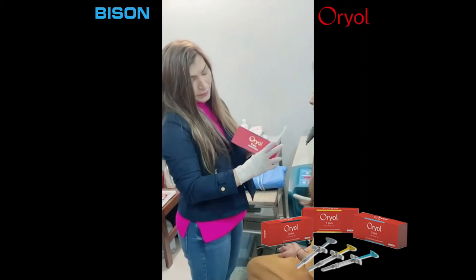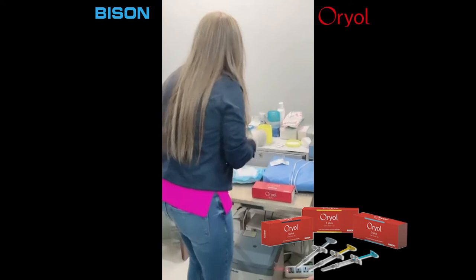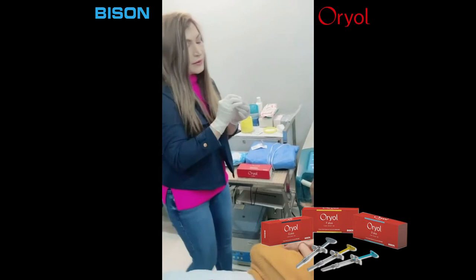I'll be using Oriole G+, 1ml. Let's see how much will give her the effect she wants. I'm going to do anesthesia first so that the numbing cream will numb her lips.